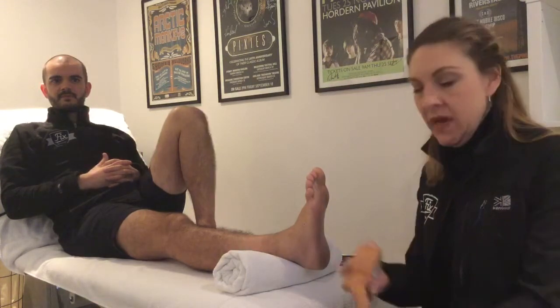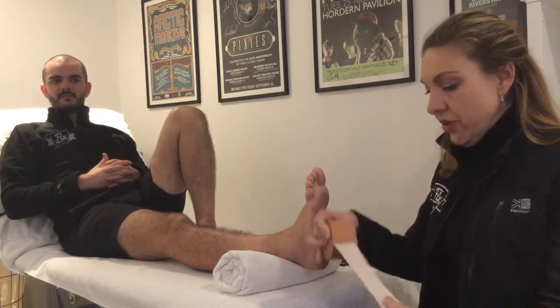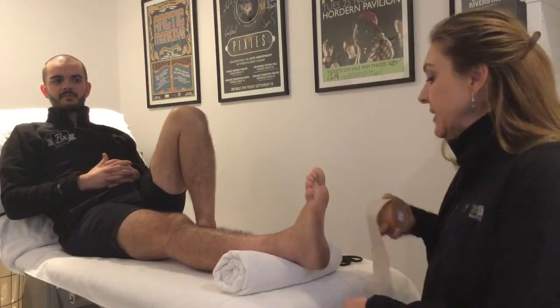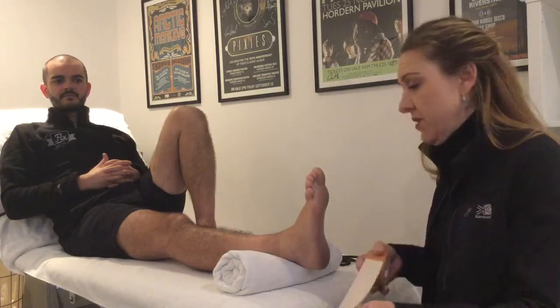Hi, my name is Penny, I'm from Fix Physio, and today we're going to show all you squad runners out there a plantar fascia tape just to support the plantar fascia. If you've had an injury or if you overpronate your feet, this is a really great way just to test out whether orthotics might be of benefit to you.